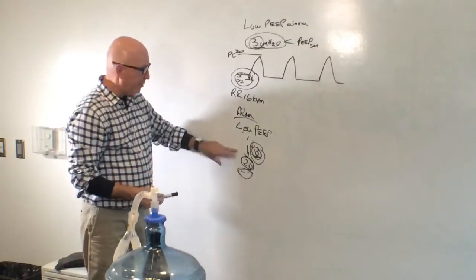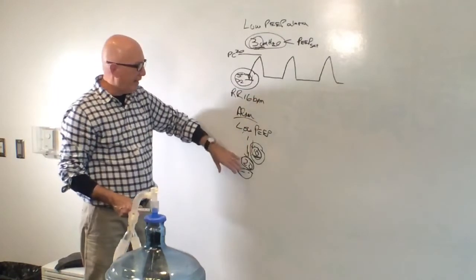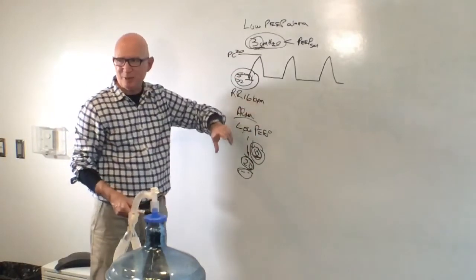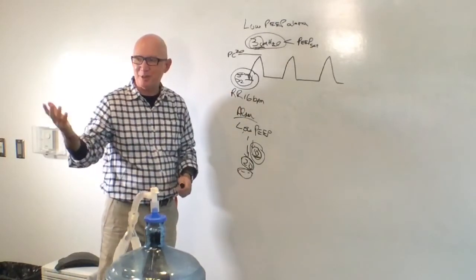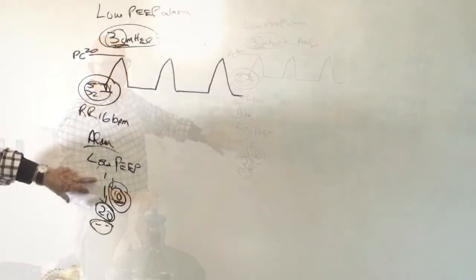The interesting thing to keep in mind is that if you turn off the machine and turn it back on again and you select a new patient, then the machine defaults all the way back to this 3 again. So changing things in the background for one particular patient is not going to save it for the next patient unless you pick the same patient, which I hope you're not doing, because we're not always the same patient. So that's an option for you in that particular case.